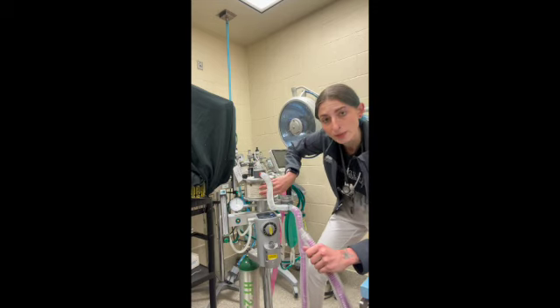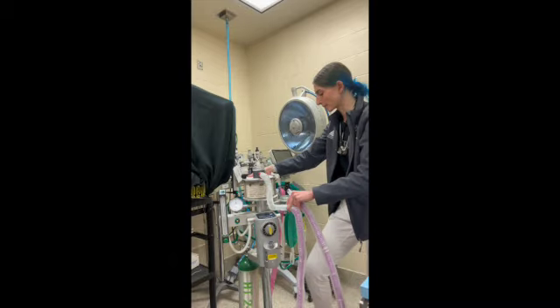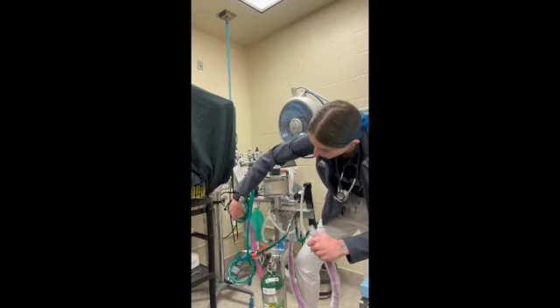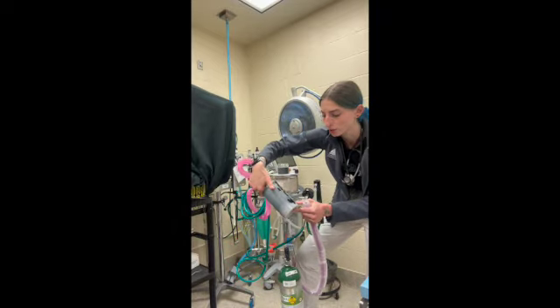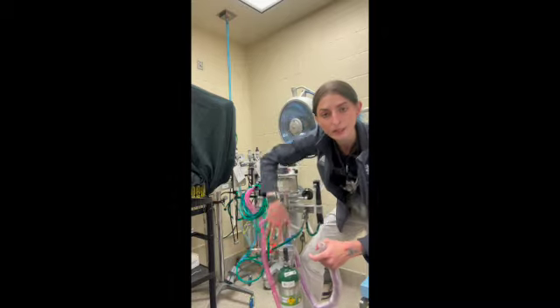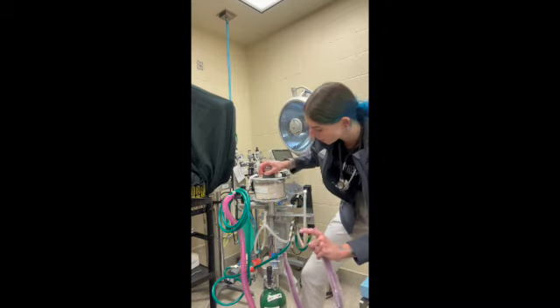And then this is our soda lime canister, which is going to absorb any CO2 exhaled by the patient. On the back side of this, it is attached to our scavenger, which is located here. This is a charcoal scavenger, and it is going to pick up any anesthetic gases that are left in the breathing system.